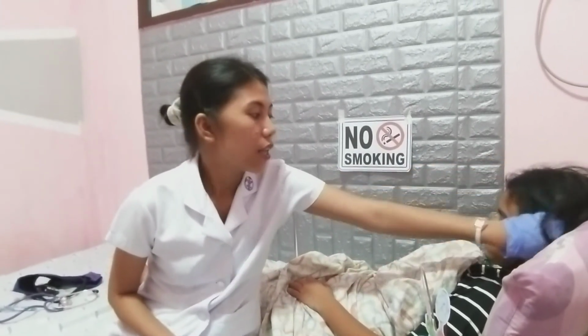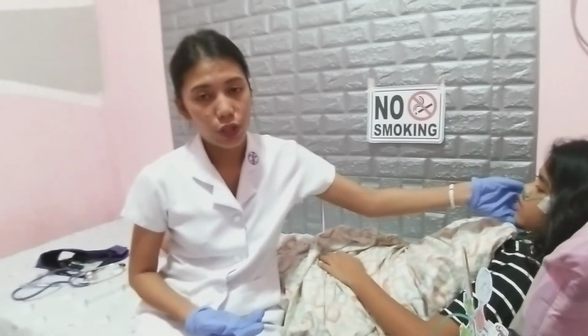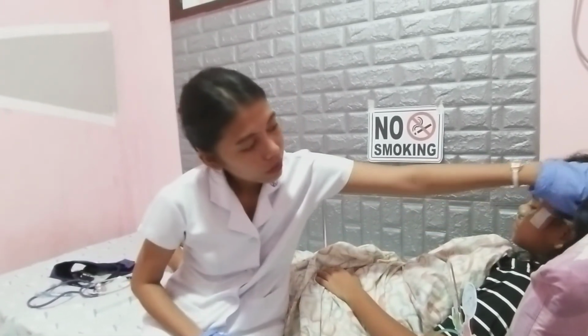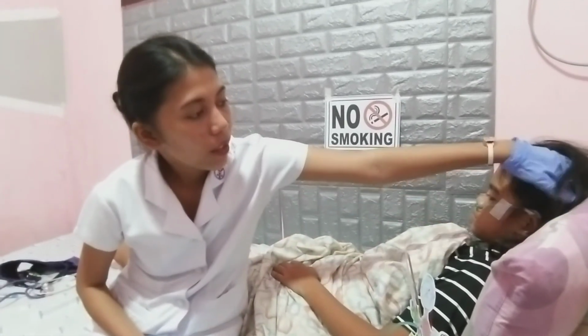So, we are going to assess or inspect the ears as well as the nose for any signs of incrustations and irritations. So we already put gauze pads to the ears' side to prevent any friction or irritations from occurring in this area. Next that we are going to do is to inspect the equipment on a regular basis.